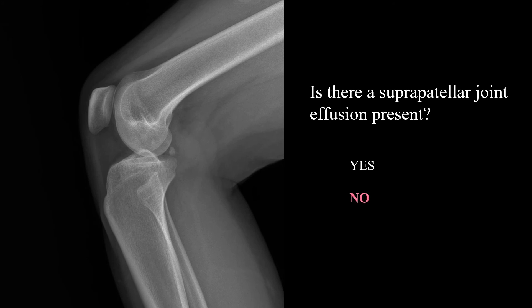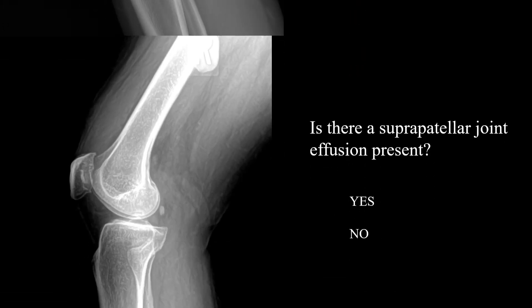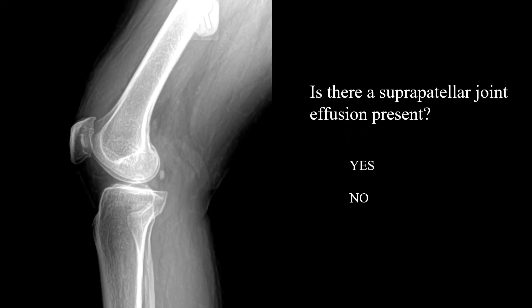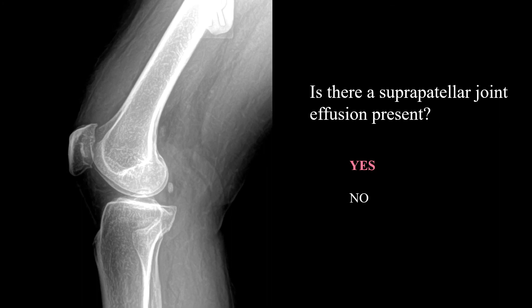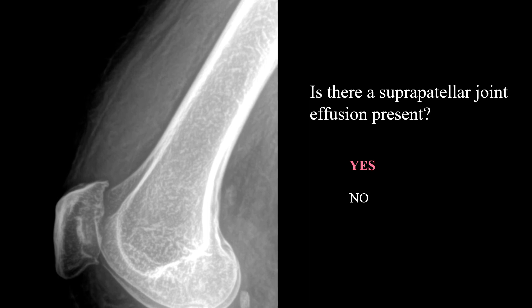No, there is not — this is a normal knee. Is there a suprapatellar joint effusion present? Yes, there is. You'll notice a very large homogeneous density in the suprapatellar region, and this is indicative of an effusion.